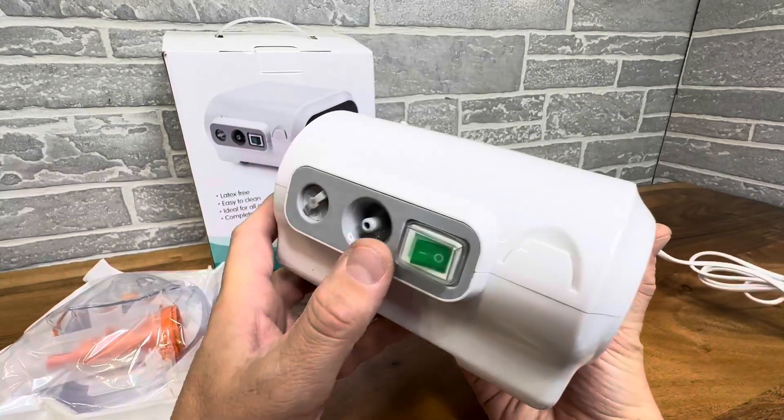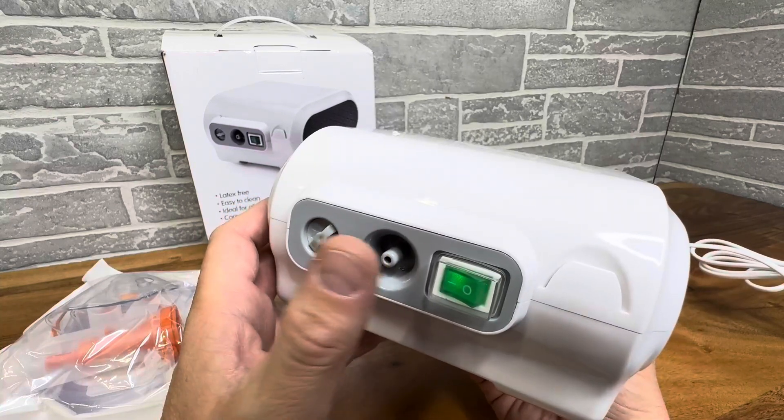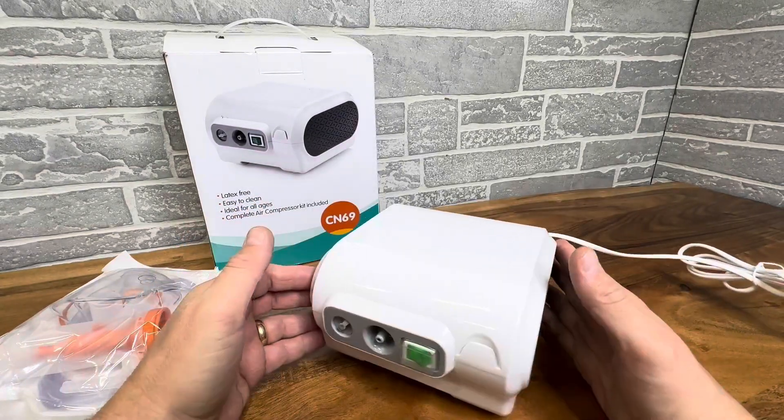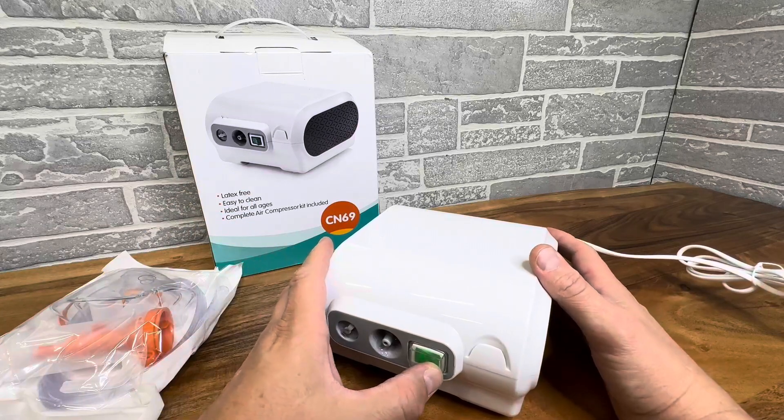It's attractive, it's small, and as you can see there's just one simple button right there. The air is pumping out, and when you set this down it's not too noisy — I mean you can hear it, but it's not that bad.